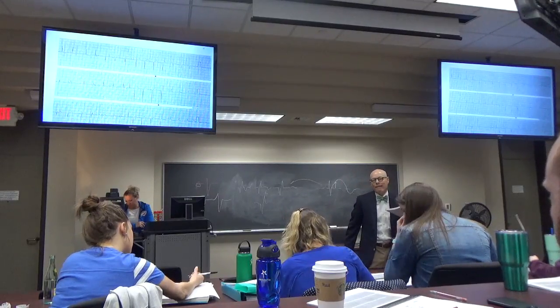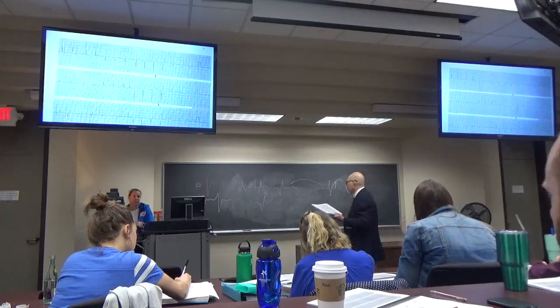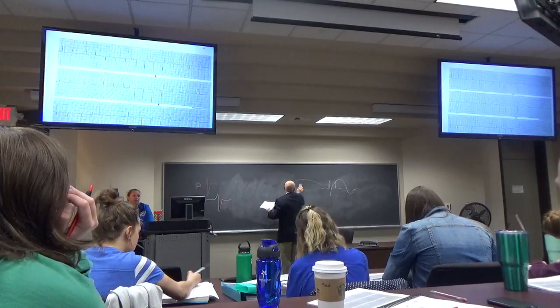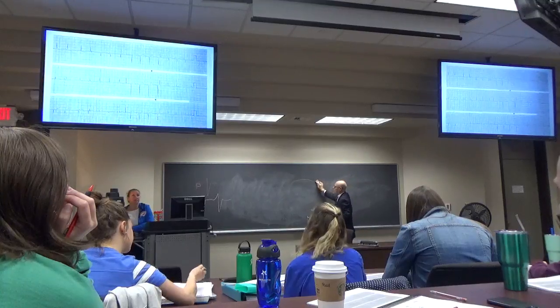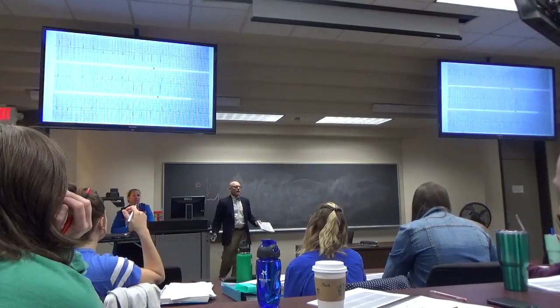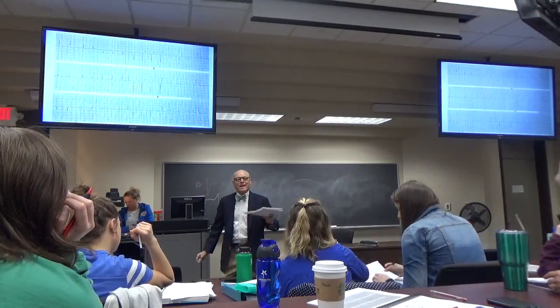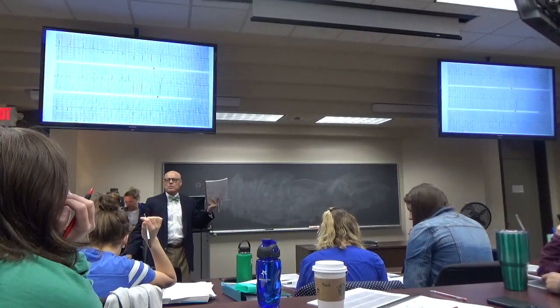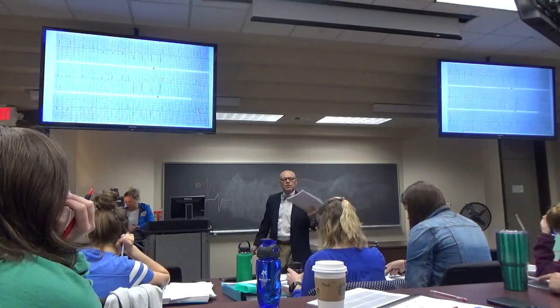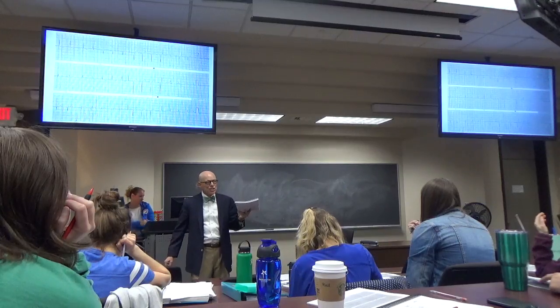Can you explain to me again the acute versus old? Because in the example infarctions, the acute was like just a Q wave with an elevated ST, but we've been calling that old. This will depend on which author you're reading. If you go online and look at EKGs, you'll find a variety of readings for acute MI. Since the mid-1980s, when STEMI came out and people started using the diagnosis STEMI, most authors changed the way they aged myocardial infarctions.